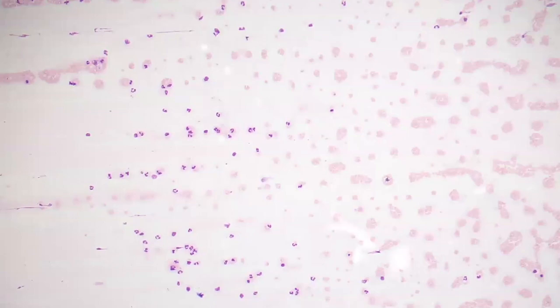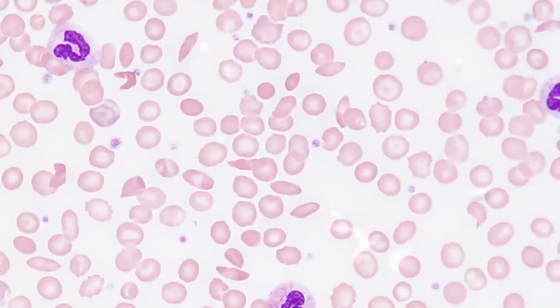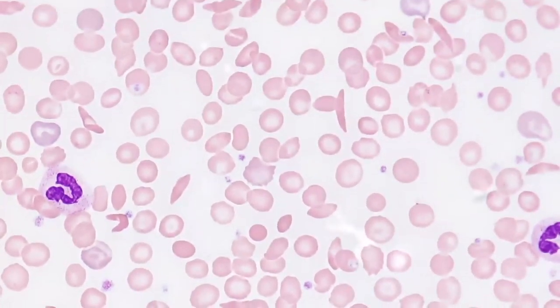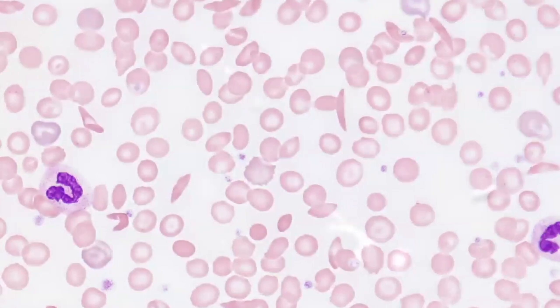So as we find our zone of morphology and go a little bit higher power, we immediately notice sickle-shaped red cells. Here's a few good examples, even in this one field, of sickle-shaped red cells. In comparison to elliptocytes, sickle-shaped red cells have pointed ends at both sides.